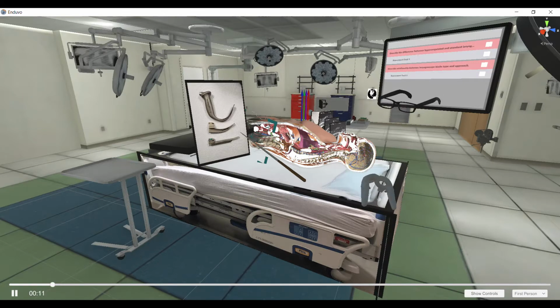And together I worked with Dr. Sarkar, who's an interventional pulmonology intensivist extraordinaire. And we put together this teaching pilot on hyperangulated video laryngoscopy. It is built on the Enduvo virtual reality platform, and we hope you enjoy it.